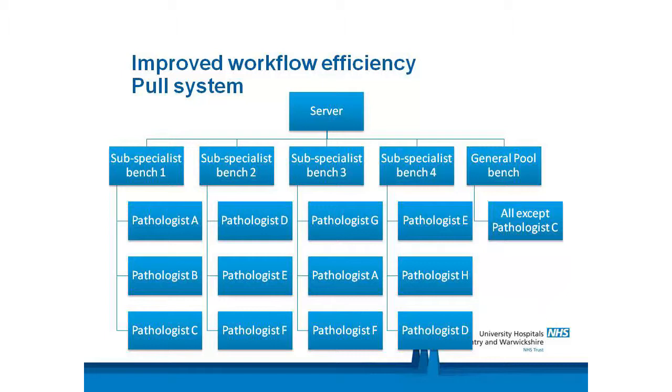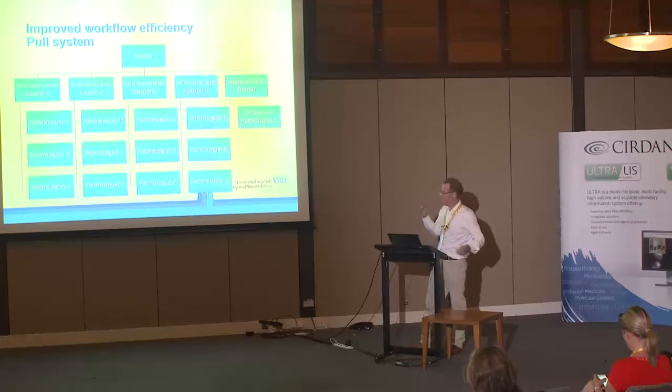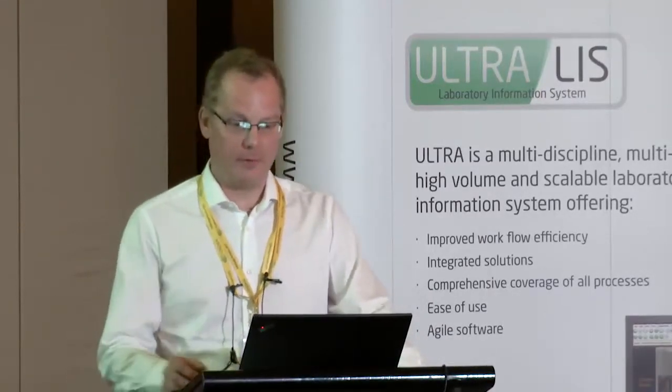And you can do this without digitization. Digitization is not needed for this, but it does allow you to do it much more easily, and you can indeed, if you want to, have complete control over how these cases are apportioned and worked through the laboratory. And we estimated that adopting this particular system of working would make a 10% saving in our consultant time, and that's what we put into our business case to support the adoption of digital pathology.